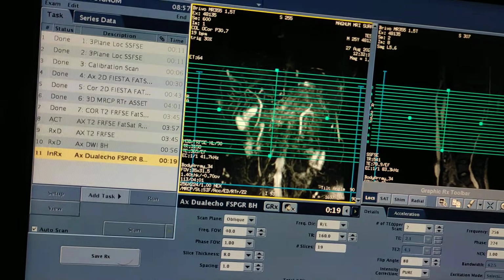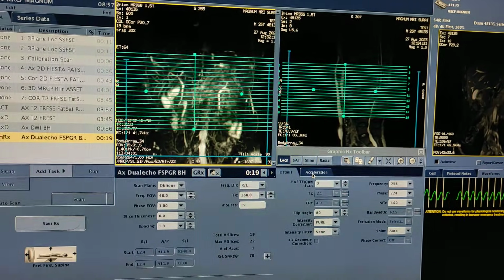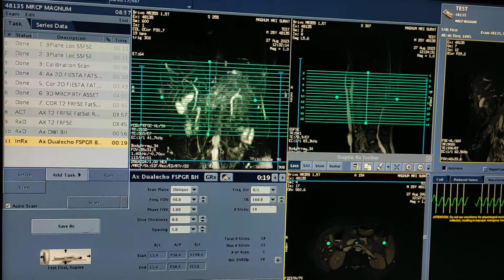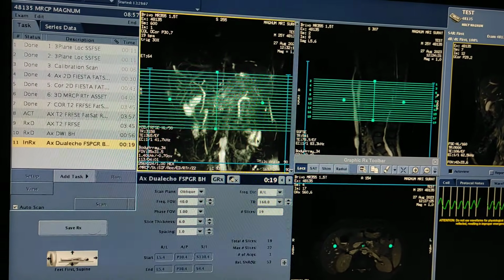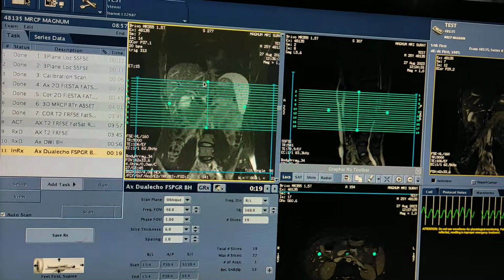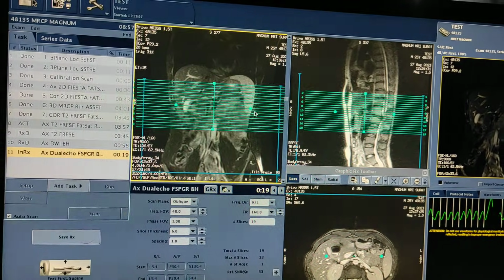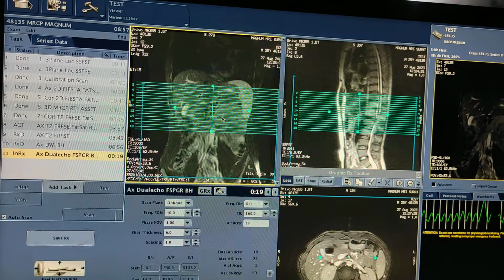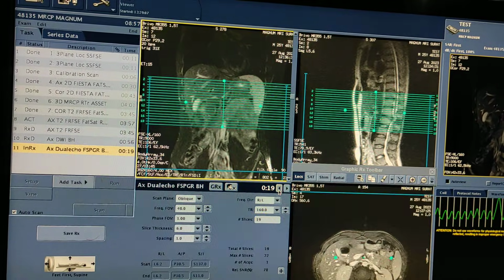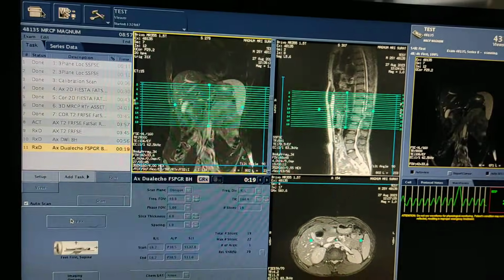Double click, open. This is a breath hold sequence. Never take dual echo without breath holding because it will give a lot of artifacts. Dual echo also. Click on this, enter the coronal T2. Dual echo is taken mainly for the gallbladder. So this is the planning for dual echo, 19 seconds. It is a breath hold sequence. I will take it at the end of the scan.